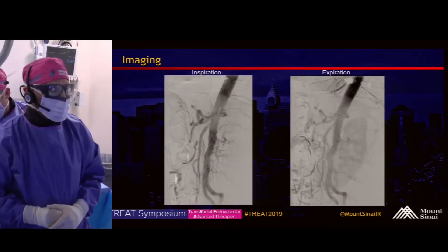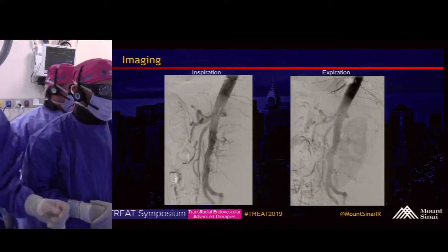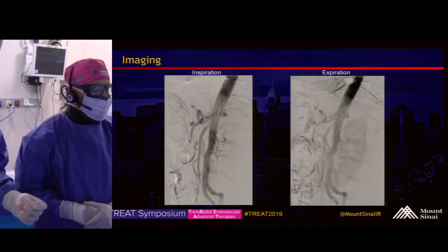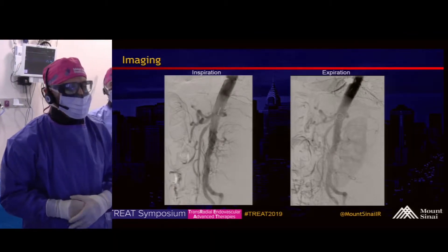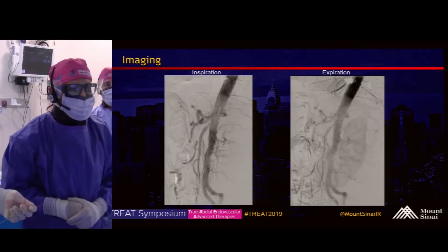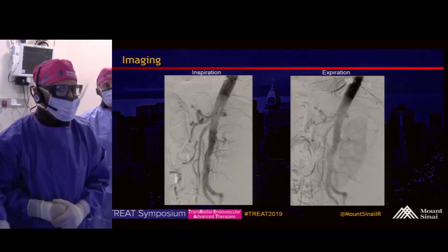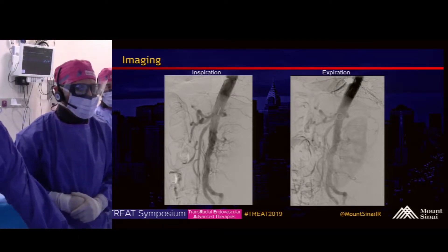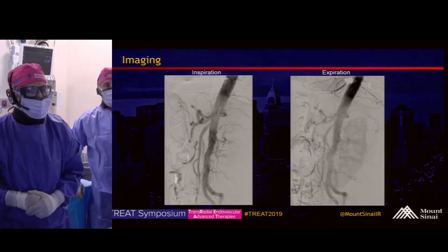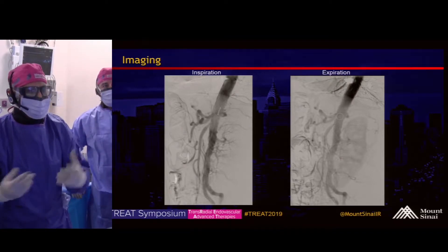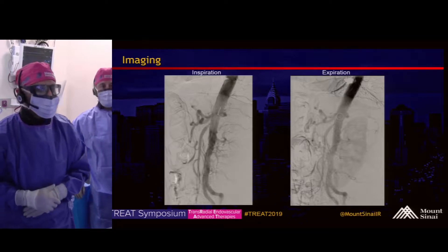On the angiogram done recently, about a week or two ago, you can see on inspiration and expiration there's no significant difference in the celiac — nothing really consistent with median arcuate ligament syndrome. But at the SMA, you can see a pretty moderate stenosis. And as mentioned, she has chronic abdominal pain, so this is what we're going to be evaluating.